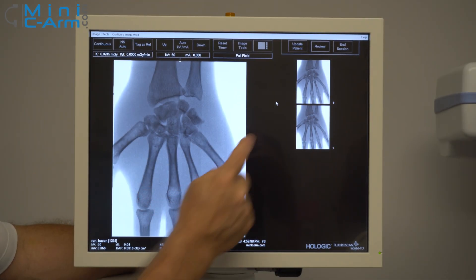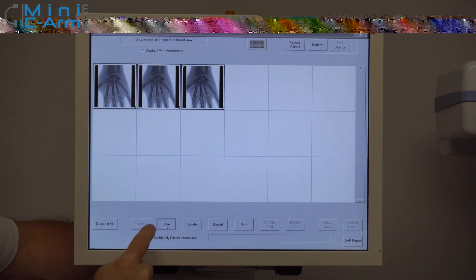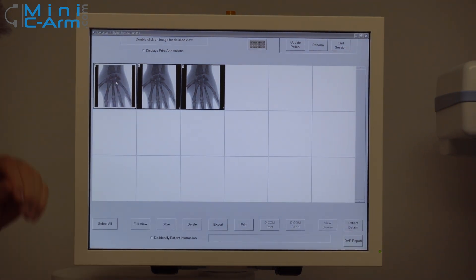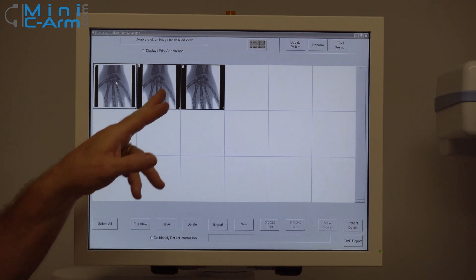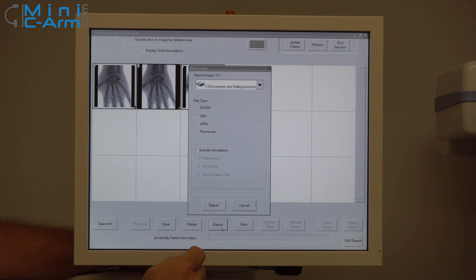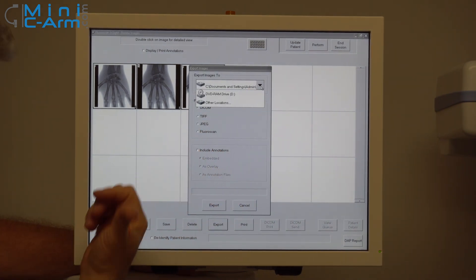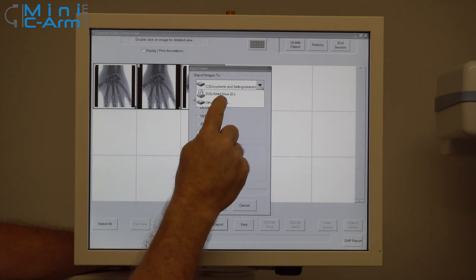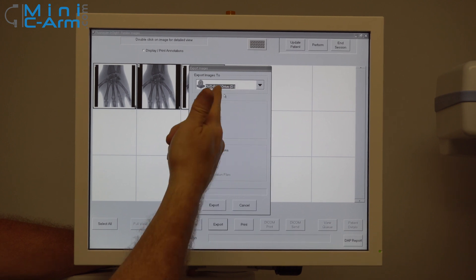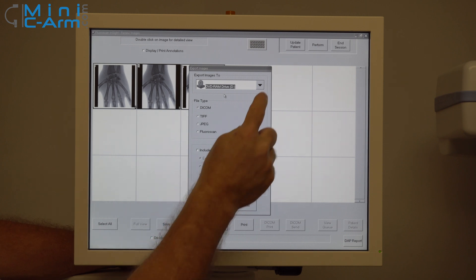So once we're finished imaging, you want to press the review button. You can select all and then save, or you can actually choose which ones you want by pressing the control button and then hit save. You can also export — if you had a USB plugged in down below, you would see it located here and just touch it. You can also hit save to the DVD drive, or save in TIFF and JPEGs for your EMR.